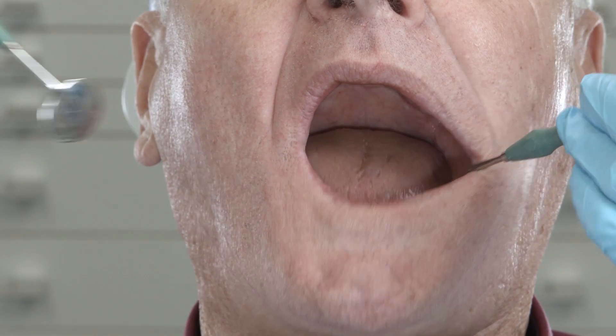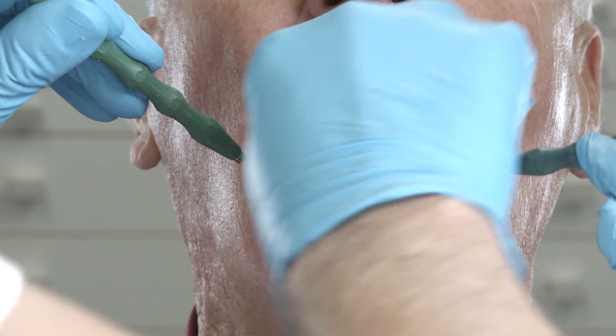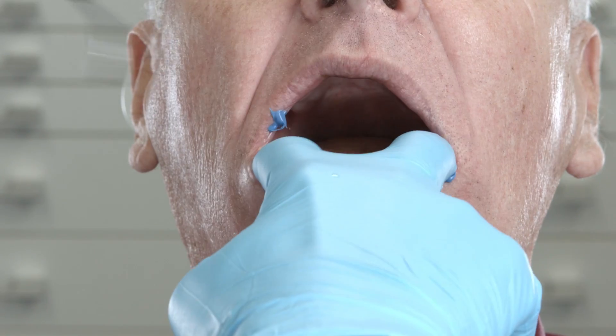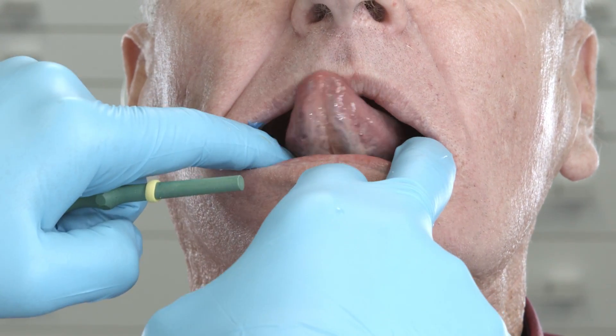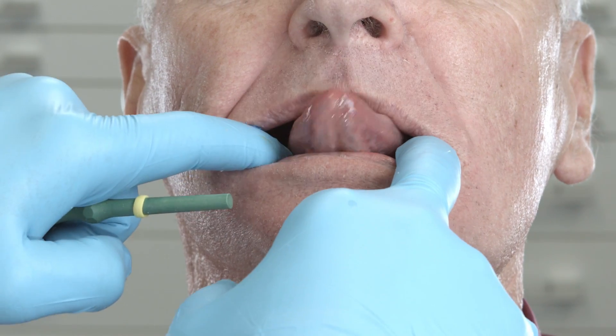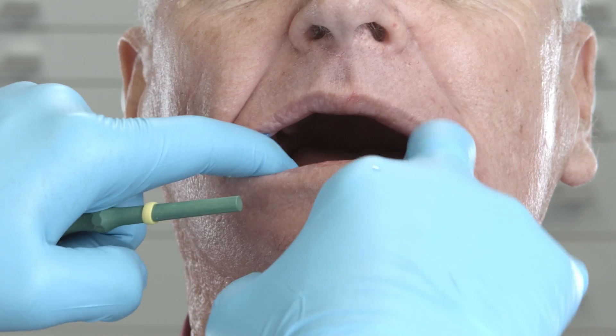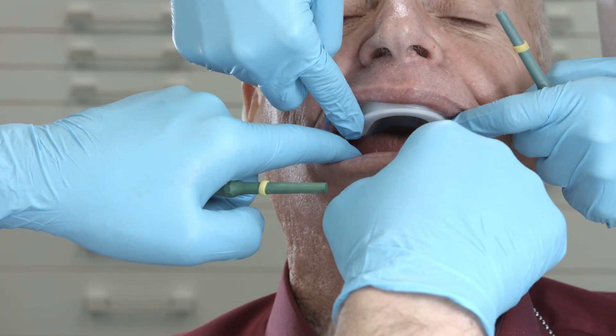The functional impression of the lower jaw takes place in the same way as that of the upper jaw. The only difference is that instead of having the patient suck on a finger, they are asked to stick out their tongue and move it to the left and to the right a few times, and then move it along the upper lip. Insert the upper impression and ask the patient to carry out the functional movements with the mouth closed. In addition, the patient should swallow once or twice.